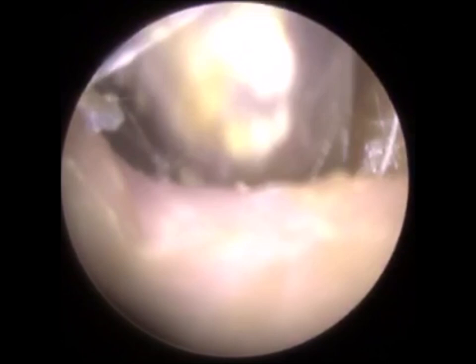But as I said, perseverance, patience is a virtue. And you can see that movement I'm using with the suction probe, I'm just wriggling, going round in circles, trying to squeeze this out of the ear canal entrance.